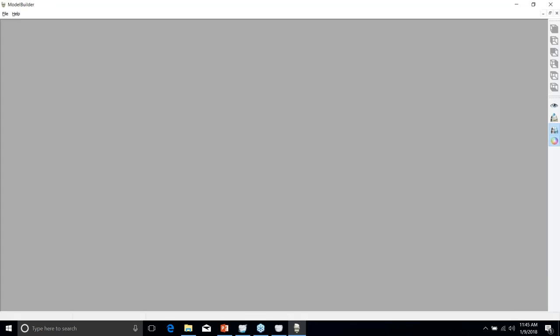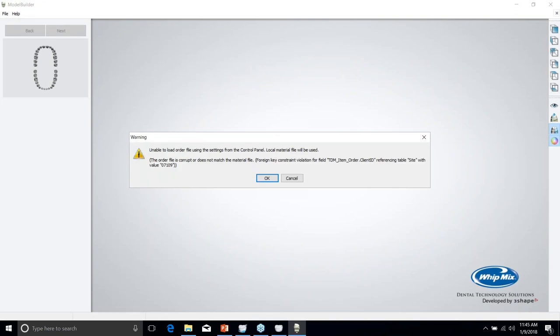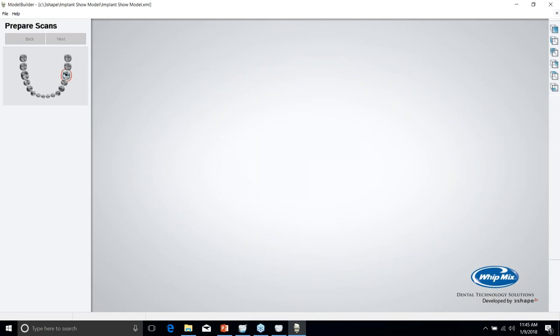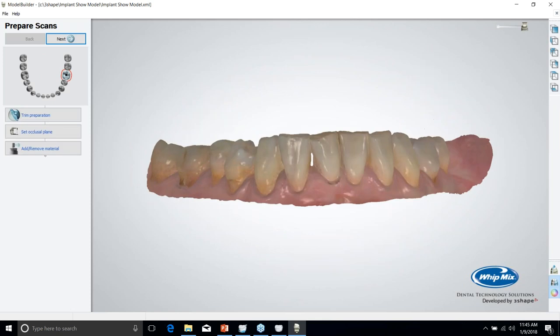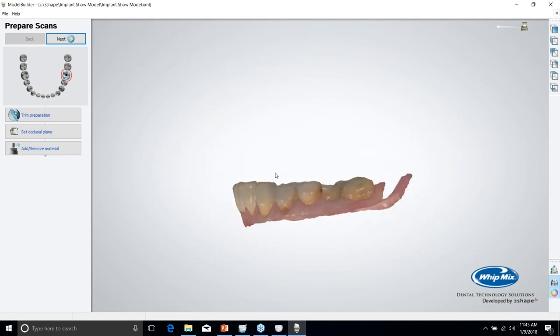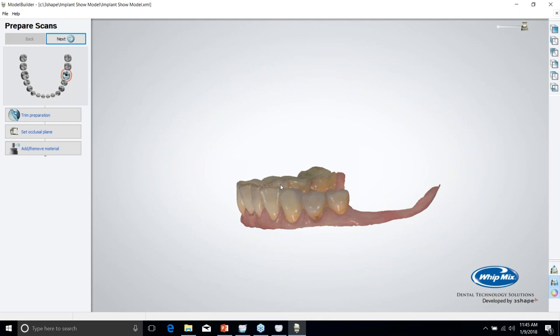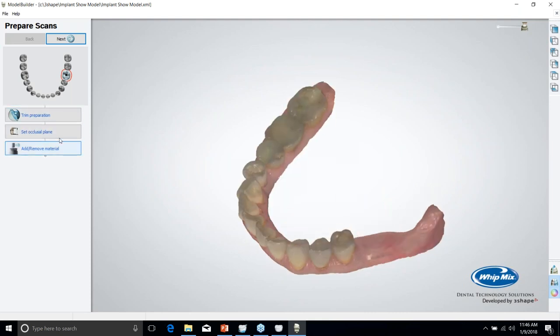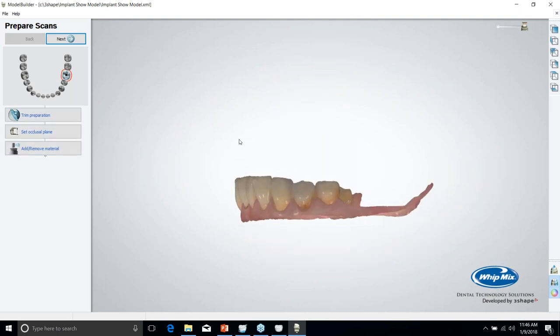So again, you probably wouldn't be doing this on a full arch scan at this time because of the limitations of intraoral scanners. But in the future, there'll probably be intraoral scanners that can handle a full arch accurate enough to do these kind of full arch implant restorations. And then you would need to know how to do this. So essentially, we have the same steps that we had earlier in the dental designer: trim preparation, set occlusal plane, add, remove material. If we already did that in the design software, we don't need to do it now, so I can just click next.